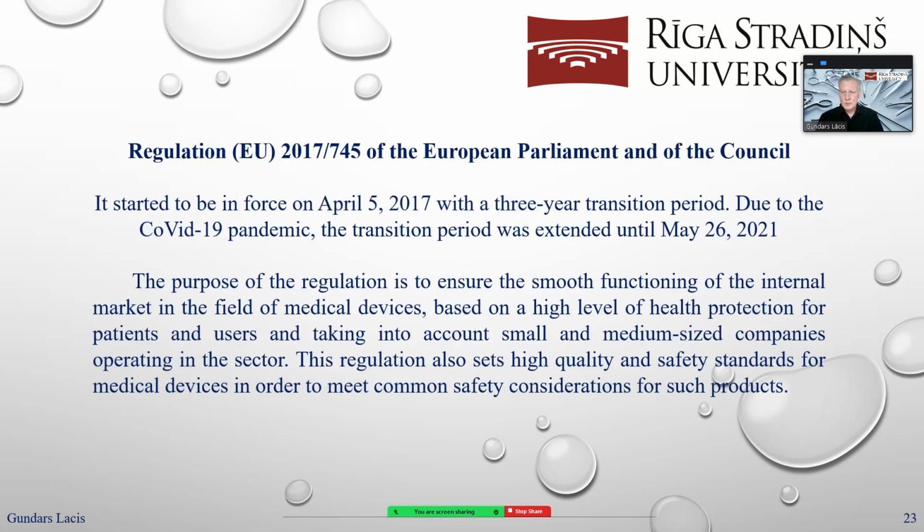This regulation was established on April 5, 2017, with a 3-year transition period, but due to the COVID-19 pandemic situation, the transition period was extended until May 26, 2021. Starting from May 26, 2021, this regulation is in force.